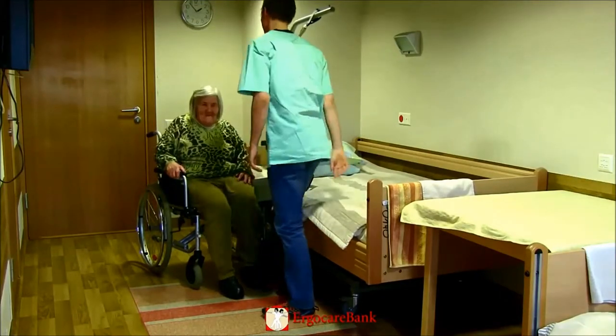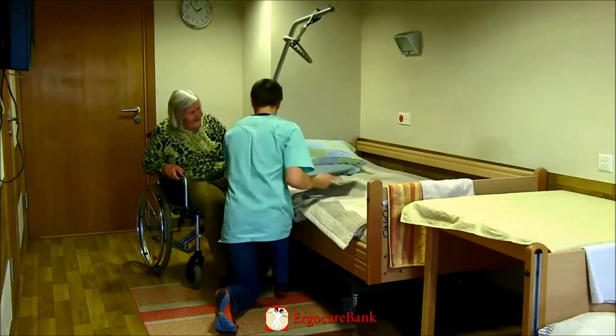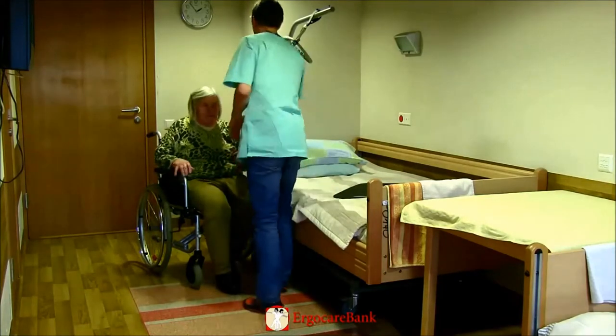When Christina is sitting well back in the chair, he removes the slide board and puts the armrest back on.